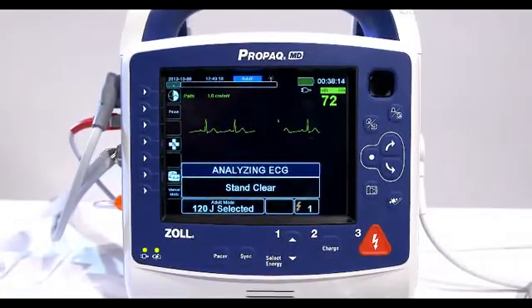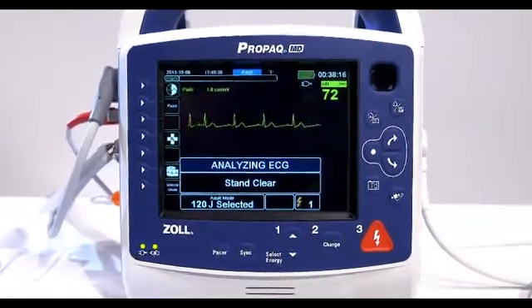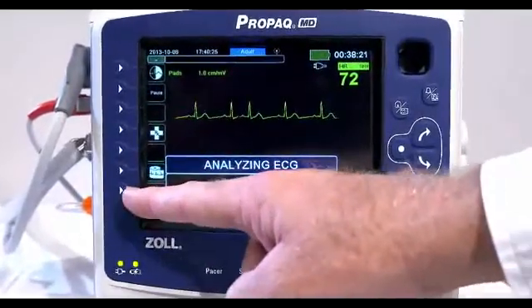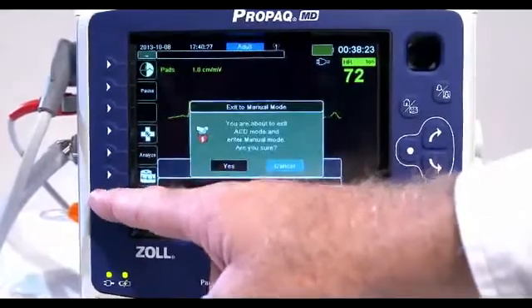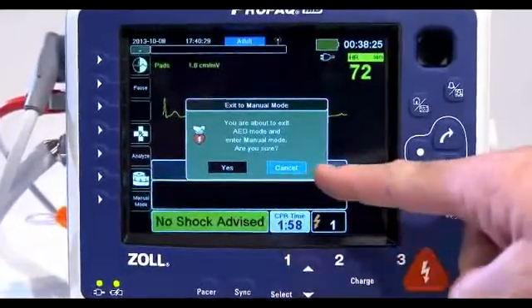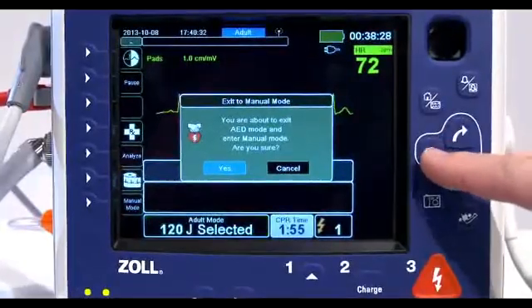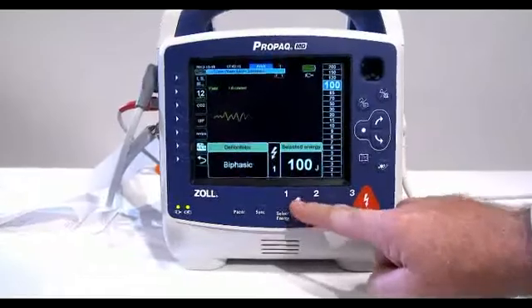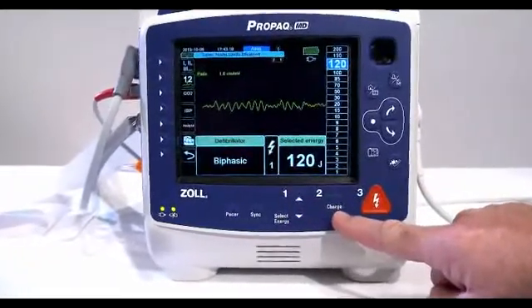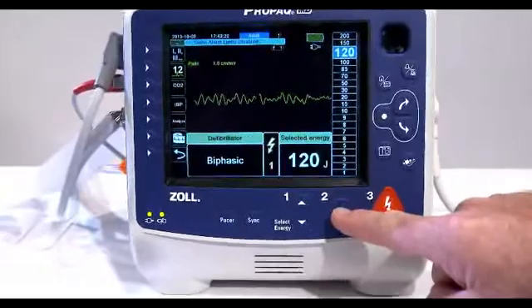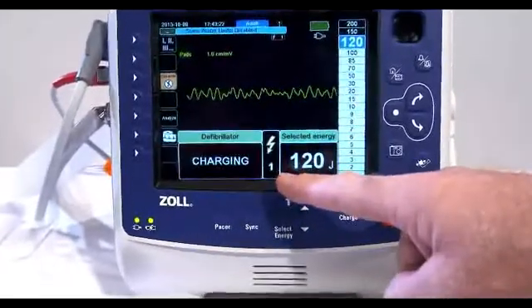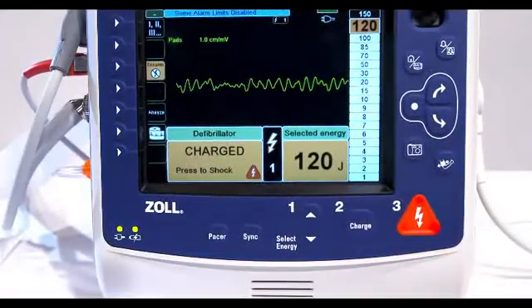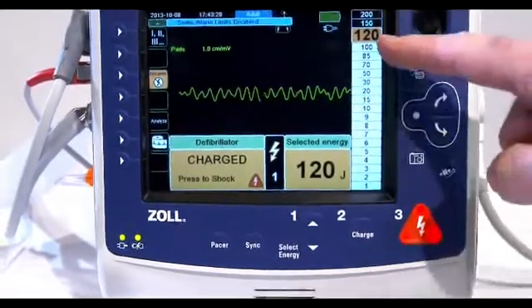Now we will review emergency hands-free manual defibrillation. Turn the ProPakMD on. If the unit is in AED mode, press the manual mode quick access key to enter manual mode. Press the energy select arrows up or down to select the desired energy level. Press the charge button on the front panel. A charging message displays at the bottom of the screen and a distinctive charging tone sounds, indicating that the unit is charging.